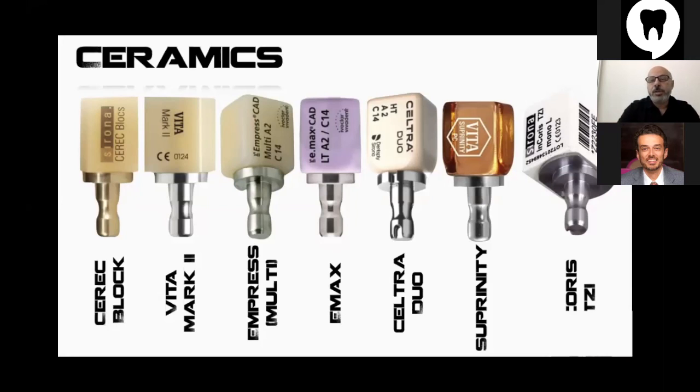And you can do monolithic restorations with these materials directly, from milling to sometimes crystallization or sintering, and then directly to the patient's mouth for bonding. So ranging from a single restoration, inlay or onlay, taking a total of 30 to 45 minutes from A to Z, to a maximum of 2 hours if we need to sinter zirconia later on.